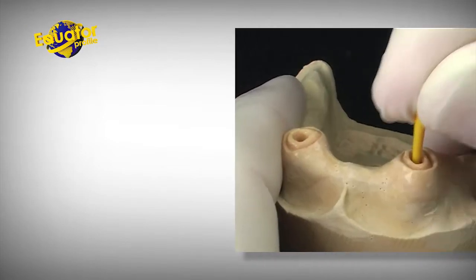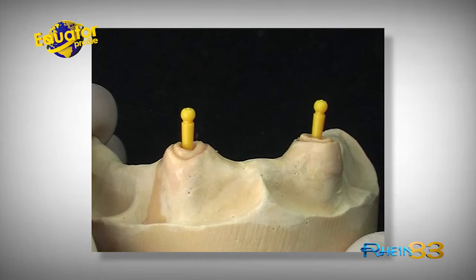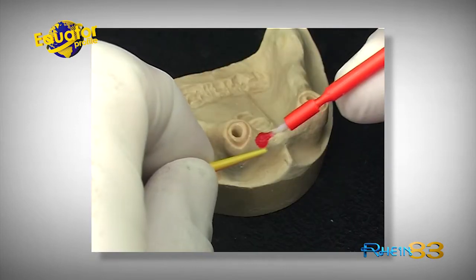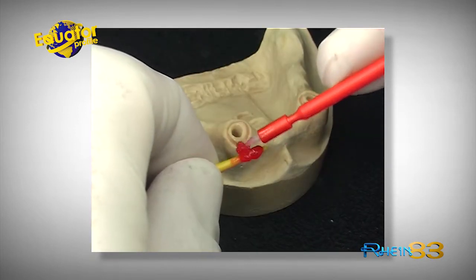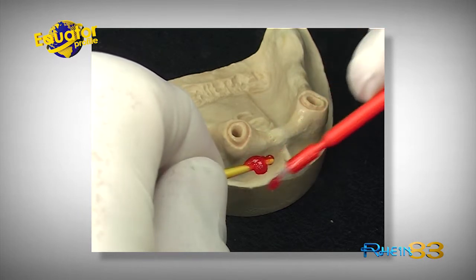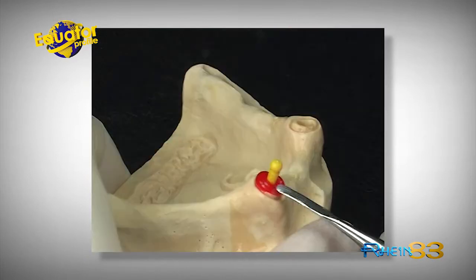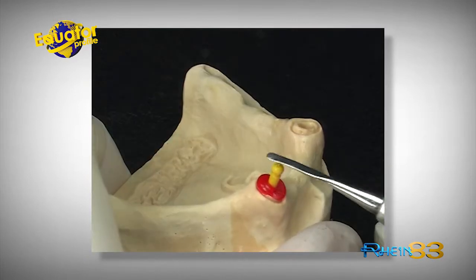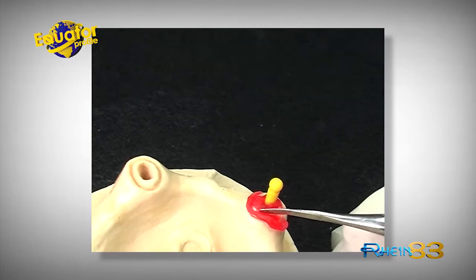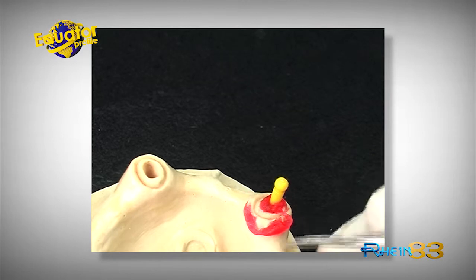Take an impression of the radicular roots with the castable pins, available in the introductory kit. Proceed with the relining of the pin with self-curing resin. Be careful to remove the pin from the roots before the resin cures.